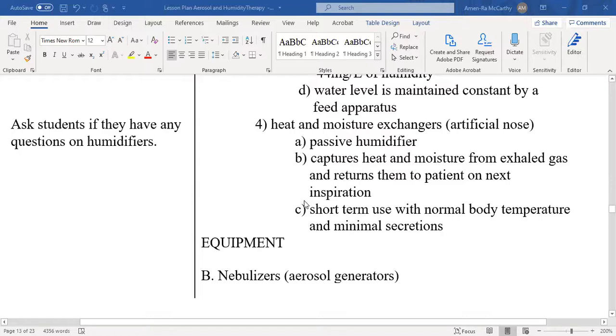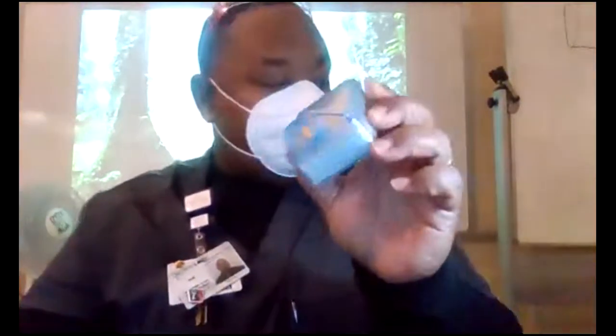So you take your bacterial filter. All right, the students are doing the HME right quick. When you come for lab, you'll be able to feel it. If you're online, you'll be able to feel it too when you come for lab. There's a bacterial filter I give you, put your initials on it so you can keep it. So when we do different maneuvers, you can put your actual mouth on your filter to the machine so it keeps it clean.